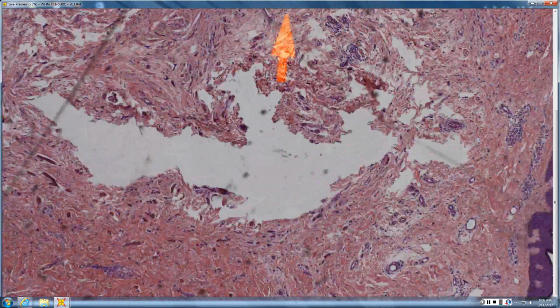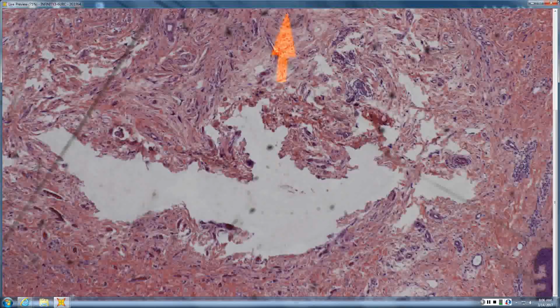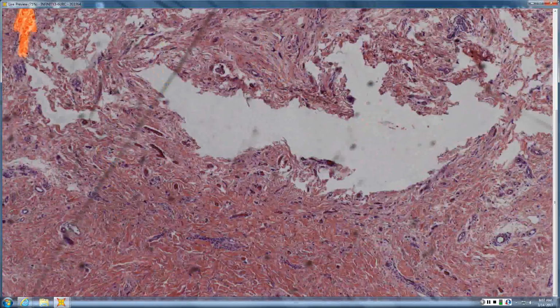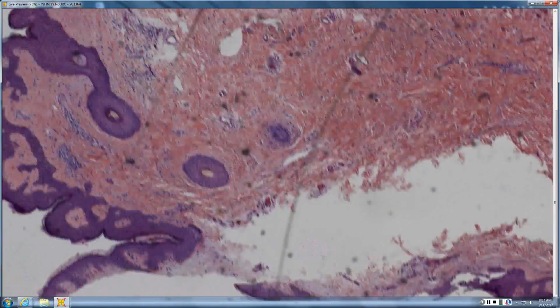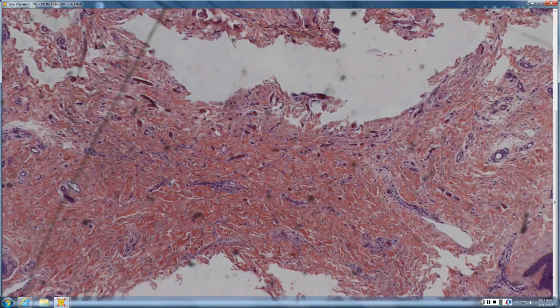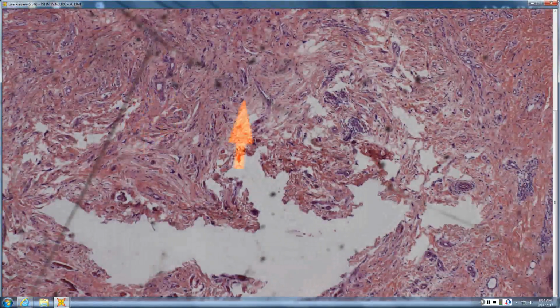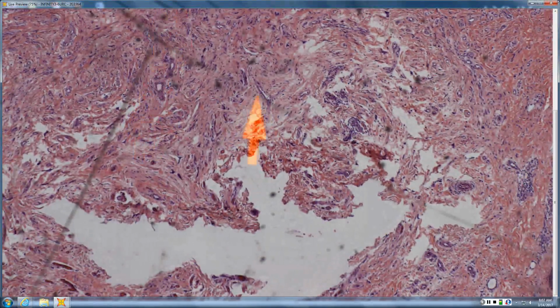Looks like a little angiofibroma. So it looks kind of angiofibroma-like, but do angiofibromas tend to be this deep, or are they kind of up here? I feel like more superficially. Yeah, so it has big stellate cells like a fibrous papular angiofibroma, but this is a deeper tumor in the soft tissue. But you said angiofibroma because there's a lot of angio here, right? Mm-hmm. There are lots of vessels, so there's an angio to this.